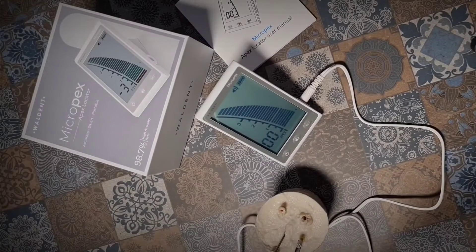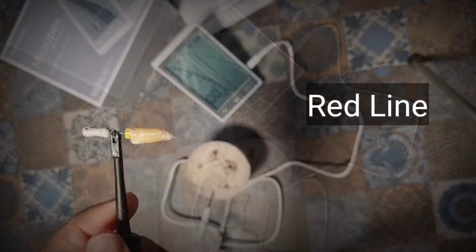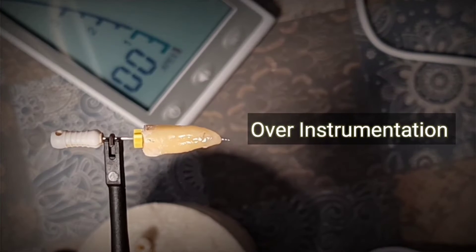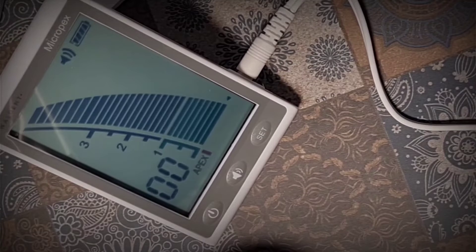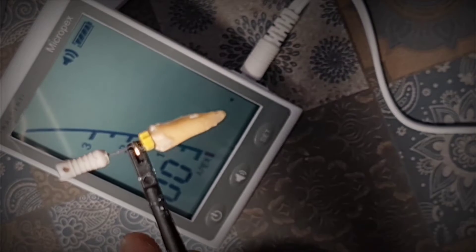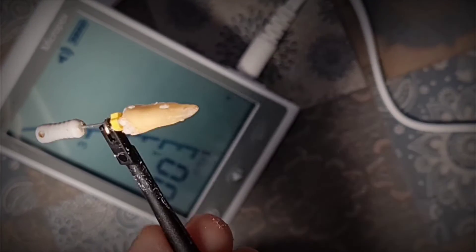A zero reading is displayed — that means we have reached the apex. If you push the file any further, an alarm will ring and the display will indicate over apex. You can see a red color line, which is a red color warning indicating over instrumentation. When there is a zero reading, that means we have reached the apex, and this is how the apex locator determines the accurate working length.